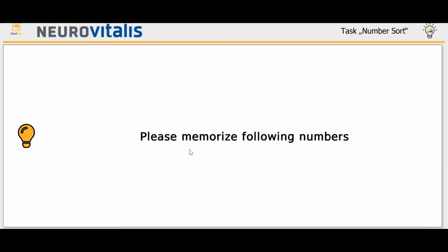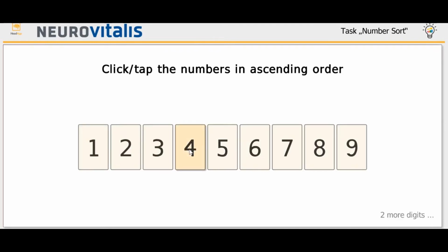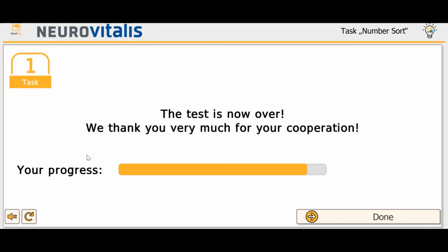First I did the correct answer. Now I will do the incorrect answer. Already done.